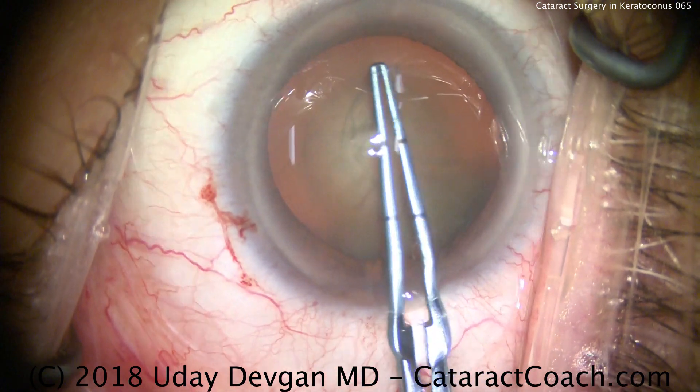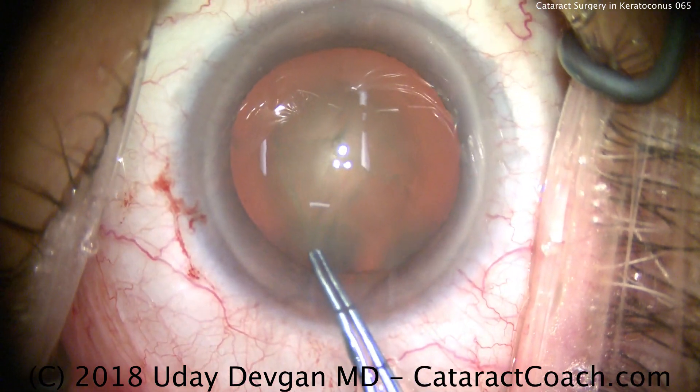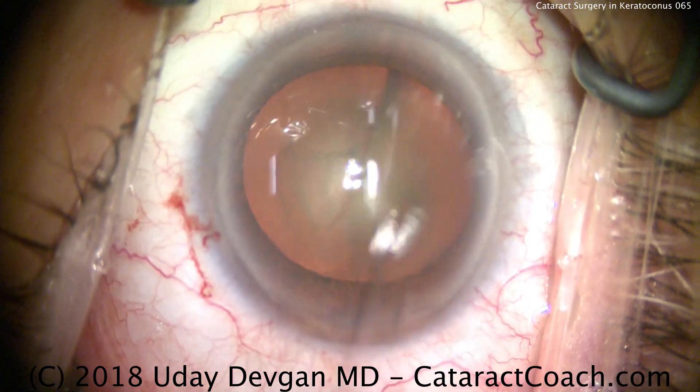The nucleus has a central density to it. The central 4 or 5 mm of that nucleus is quite dense, while the peripheral part of the nucleus is not as bad.